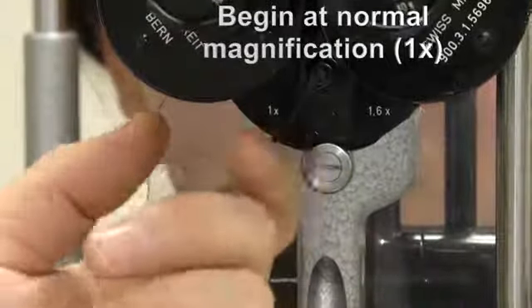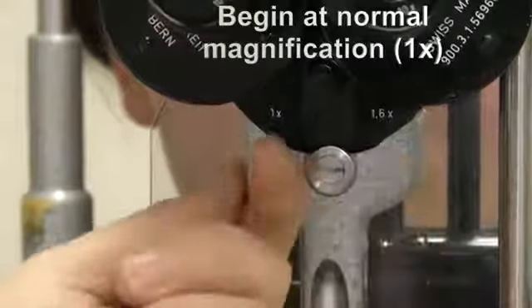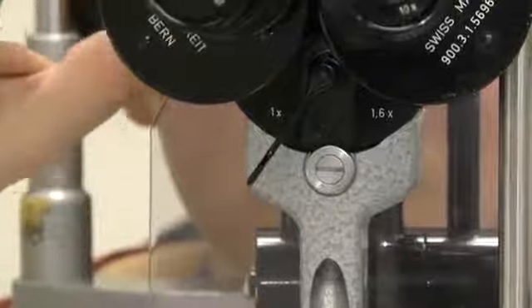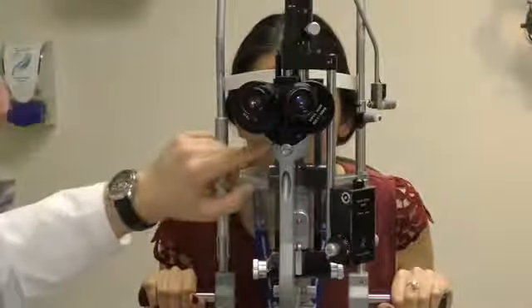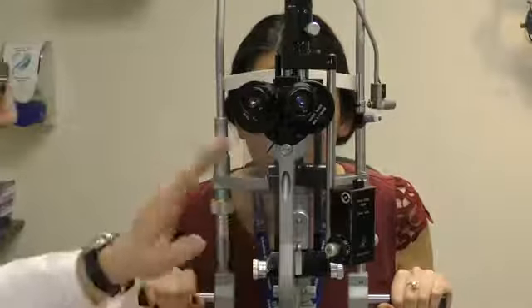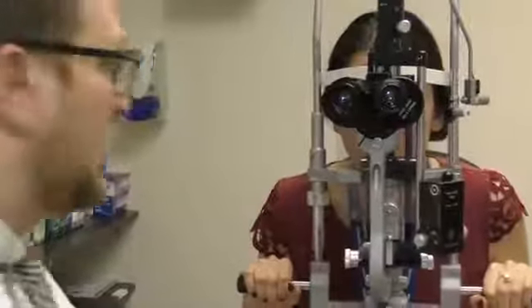It's always best to keep it at 1x zoom when you're first doing your exam instead of the 1.6 or the 2x zoom. Sometimes there's a magnification bar on the newer machines on the side. It's a dial that you can rotate. So always make sure it's on 1 when you start your exam. And later I'll show you why you need to increase magnification to look at certain parts of the eye. Okay.